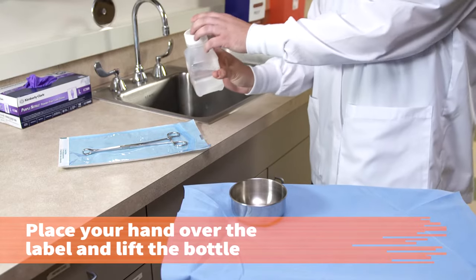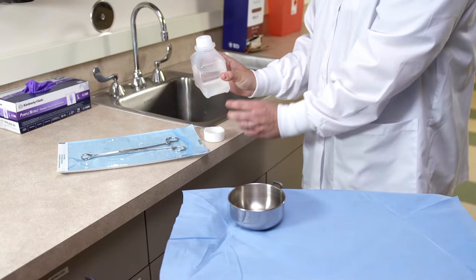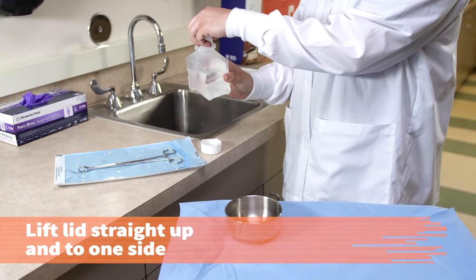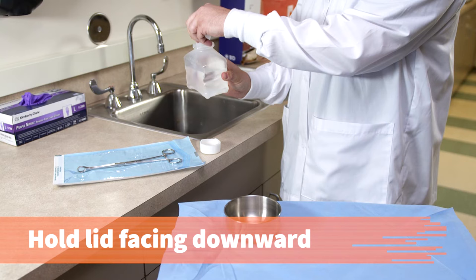Place your hand over the label and lift the bottle. If the container has a double cap, set the outer cap on the counter, inside up, before proceeding. With your non-dominant hand, lift the lid of the bottle straight up and then slightly to one side. Air currents carry contaminants that could settle on the inside of the lid, so continue to hold the lid facing downward.